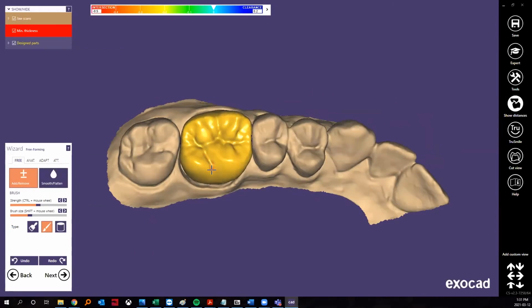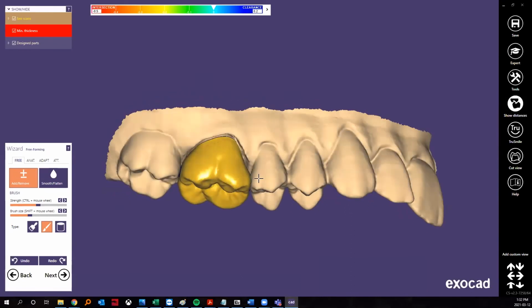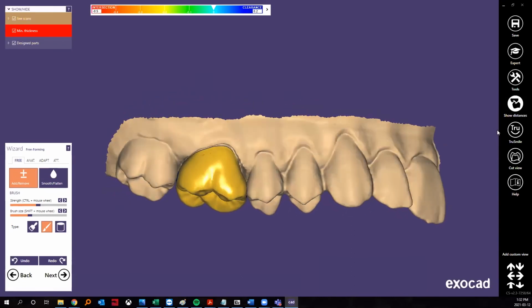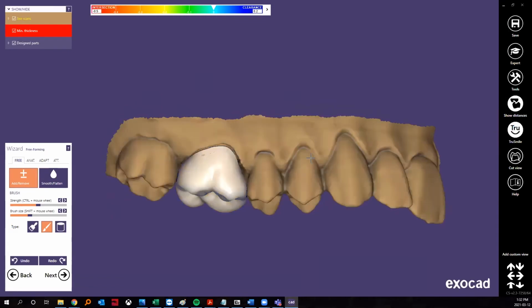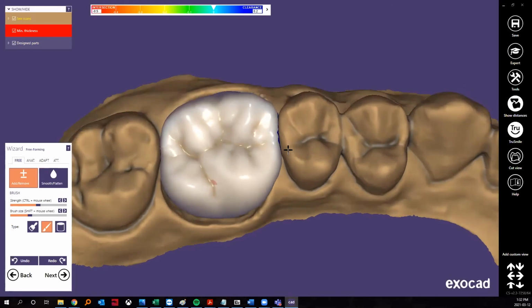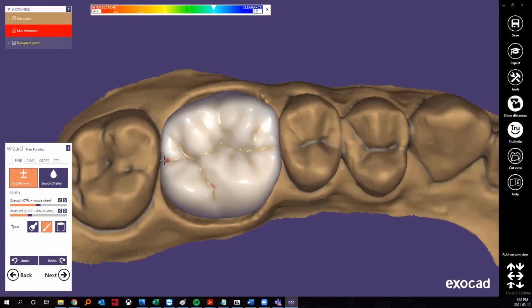So if I want to make this a little more pronounced. And one thing I want to point out is if you want to show the patient while they're in the chair, or if they're nearby, if you're trying to do this quickly, one useful tool, instead of them seeing a yellow tooth, which they're going to be questioning themselves on what they're getting exactly, the True Smile module will actually enable you to show tooth color. So this actually makes it a little more realistic, easier to show, and the patient might have a little less concern than getting a yellow tooth.